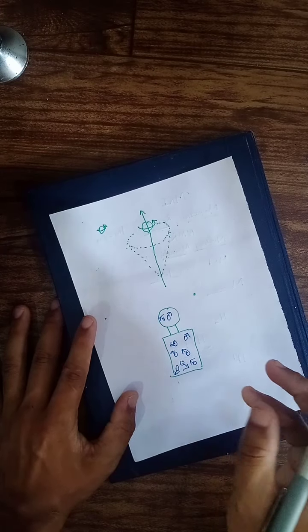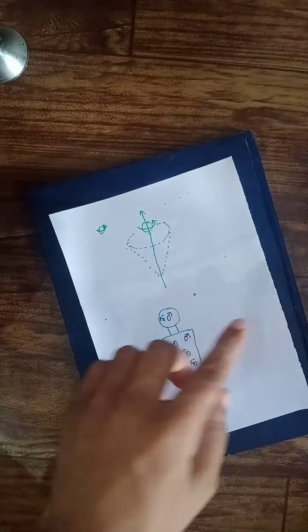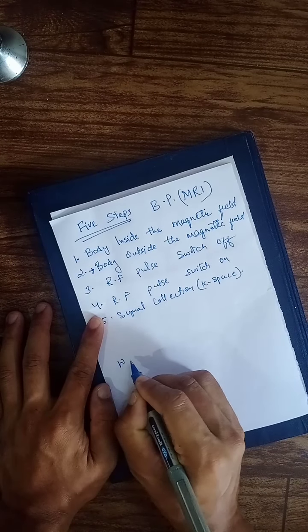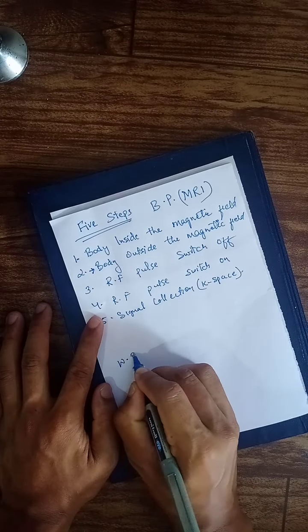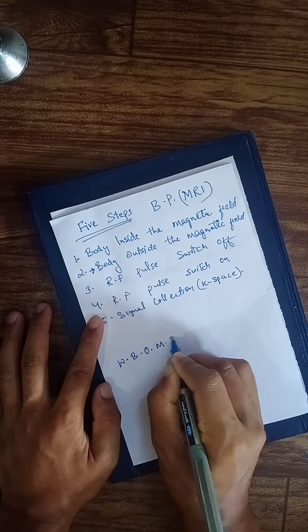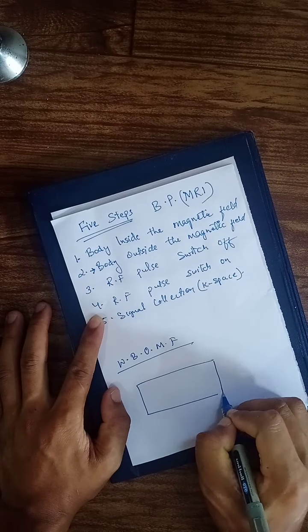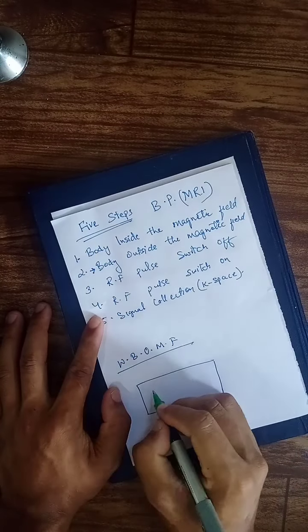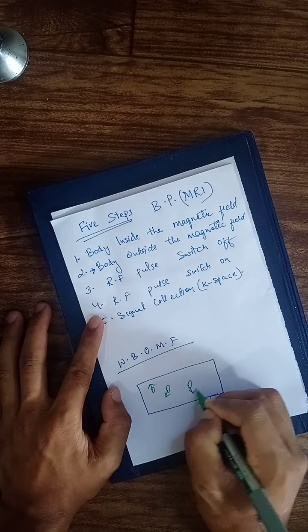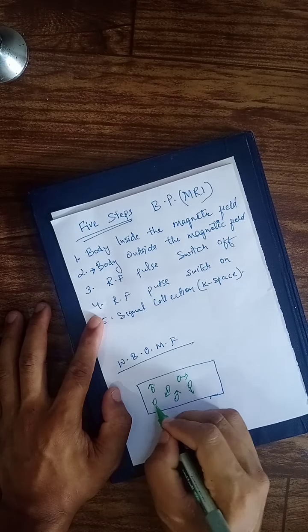Why? This is what exactly happens. In the first step, when your body is outside the magnetic field, let me draw here. I'll write in short, when the body is outside the magnetic field, what happens? Suppose this is your body, and let me change the color. It's in random motion. Can you see?